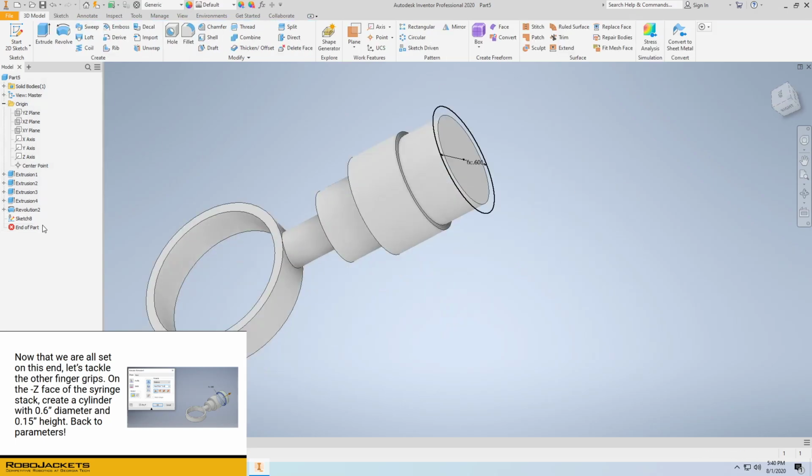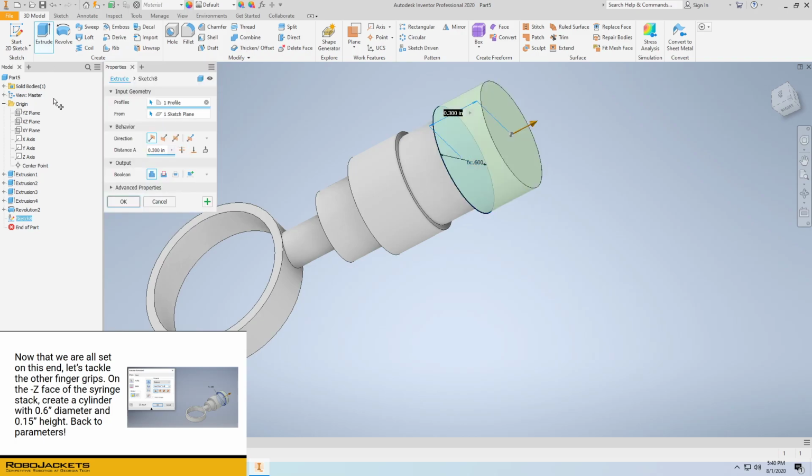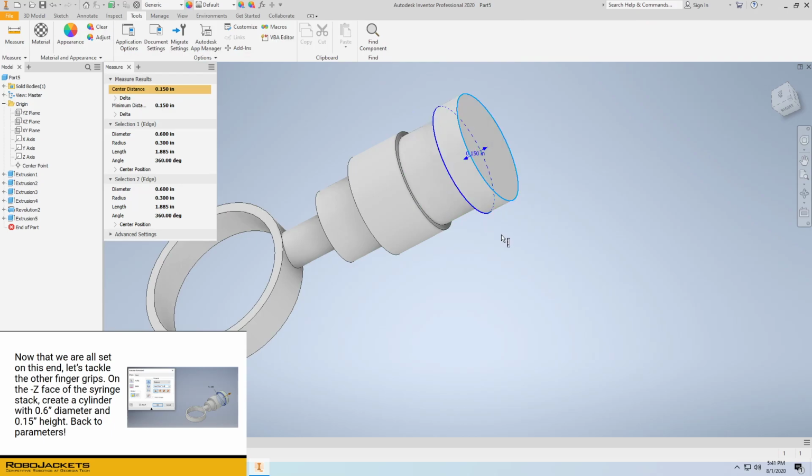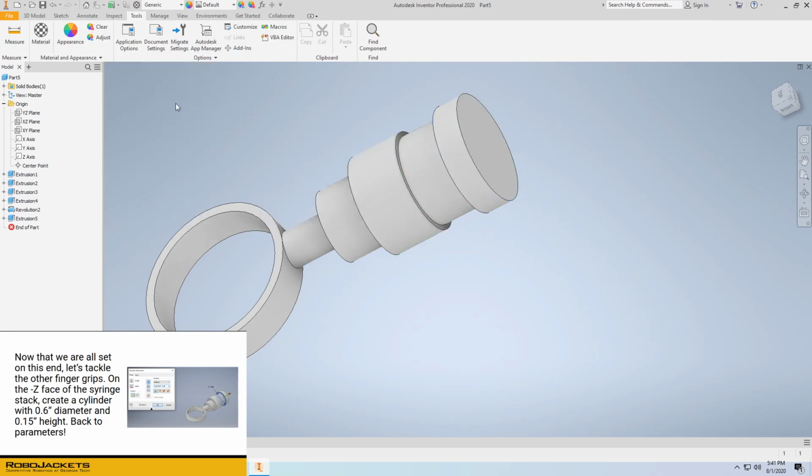Now, we'll extrude that sketch to a height of 0.15. This should be back on parameters though, and if we know that the height of the main thickness is 0.25, we want a 20% decrease. 40% decrease. So actually, it will be 0.6. And if you want to measure this out to be sure, yep, 0.15.